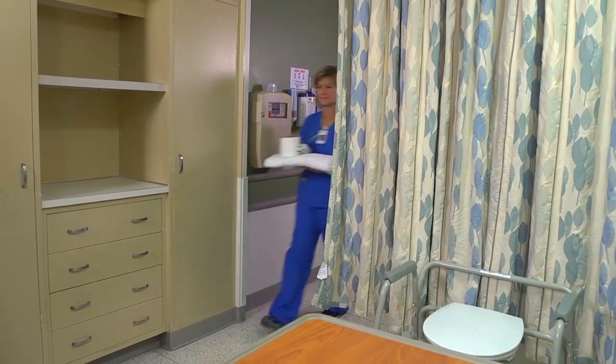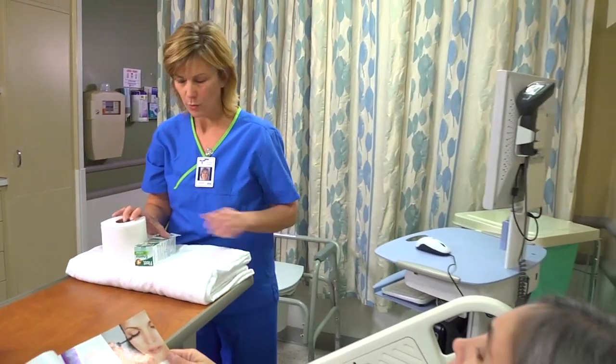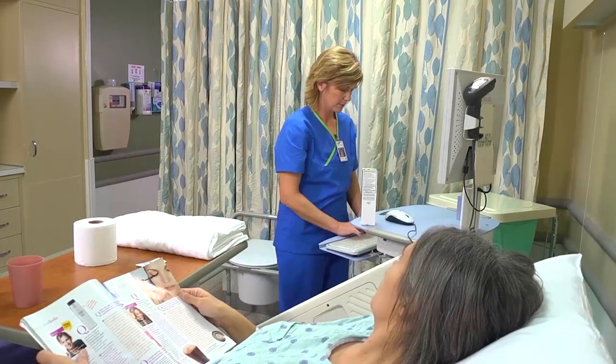An enema can be used to treat constipation or to prepare the bowel for certain procedures. Before you administer an enema, introduce yourself to the patient. Note the patient's name, the type of enema ordered, and the time of administration.